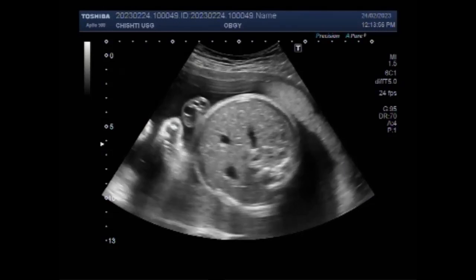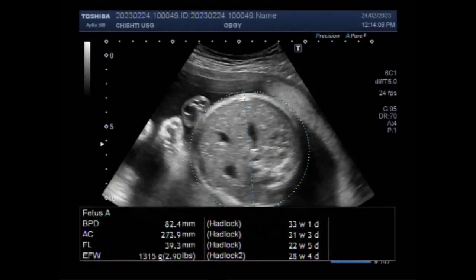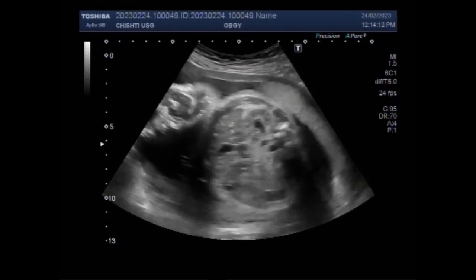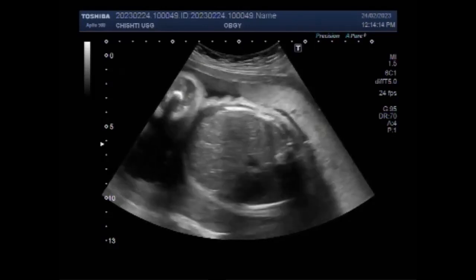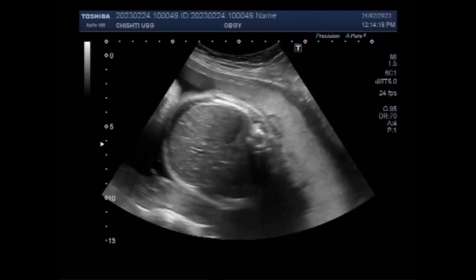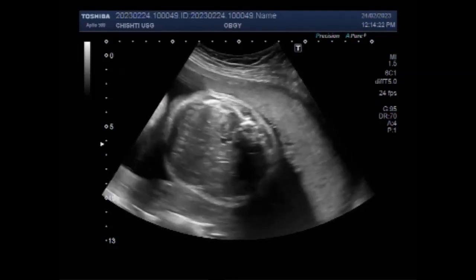But in this case, there is the fourth pregnancy with two female patients affected, one male child spared. This is a female fetus, so heredity seems to be involved in this case, as you are going to see in this video. Ultrasound can provide adequate evidence of fetal limb deformities evaluation in most patients.